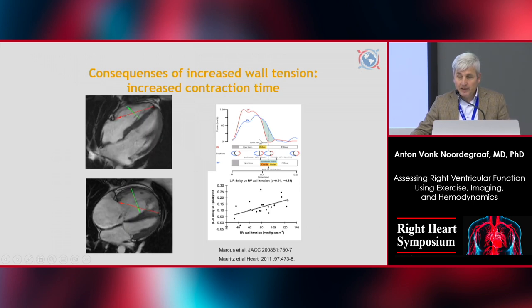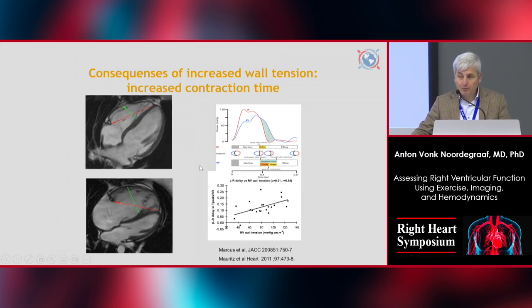So you can see it here, this is the figure. This is the right ventricle pressure tracing, this is the left ventricle pressure tracing. It leads to the circumstance that at a certain moment of time the pulmonary valve closed, but the right ventricle still continues to contract, which is called a post-systolic isovolumetric contraction time. Not very energetically efficient, but this is what happens.